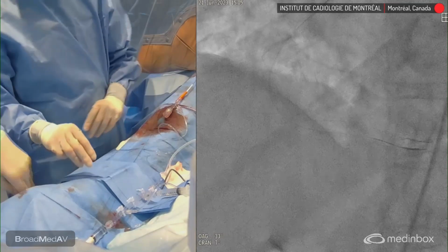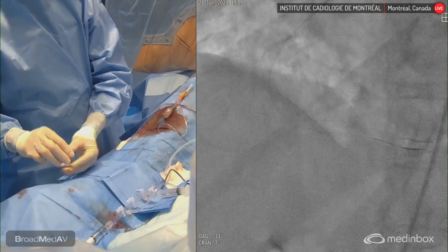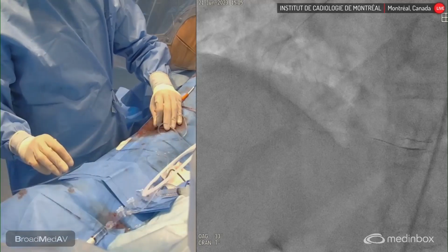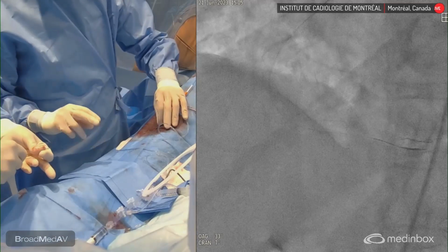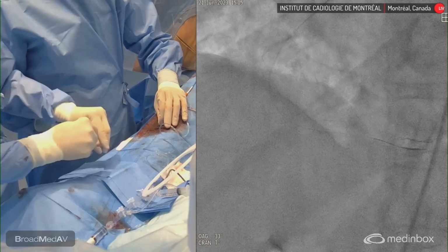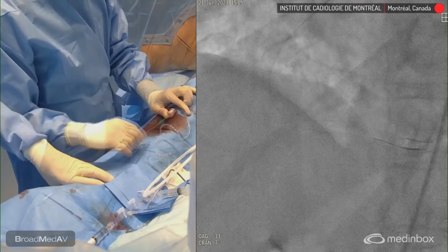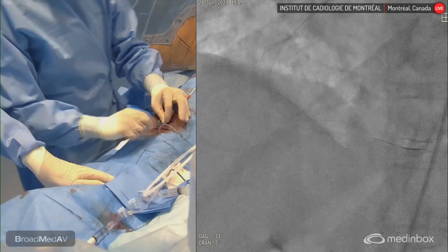And of course, the plan for now is to optimize the bifurcation. Once this is done, of course, stent until we reach our proximal landing zone, which is in this case the ostium of the RCA. So can we get back our slides because I see it's getting to 3 o'clock, and maybe we'd just like to go over a few things before we go offline. The rest of this is just basic, usual stenting, and we're going to deal with the bifurcation provisionally. We're going to implant another stent proximal, and then we'll do IVUS to finish off.